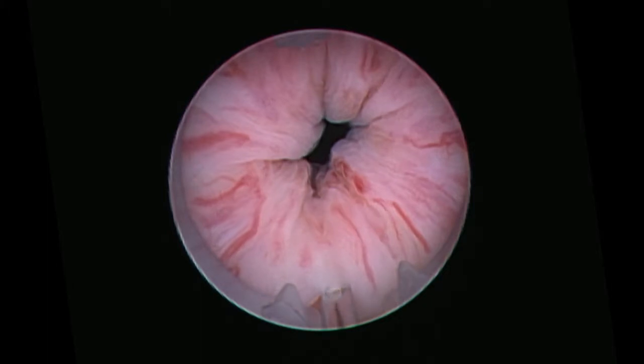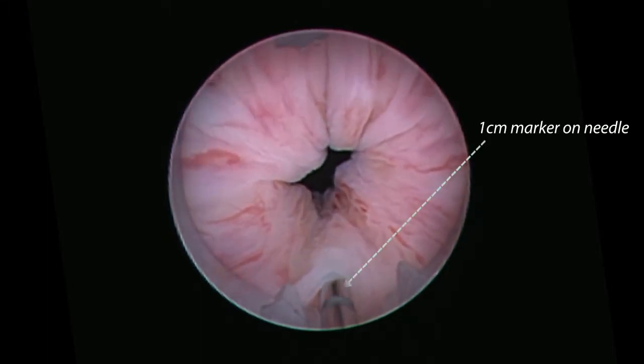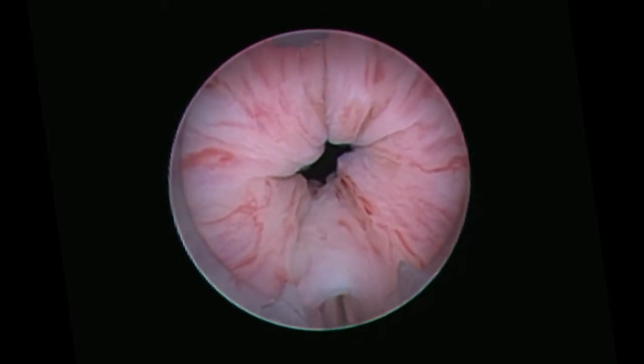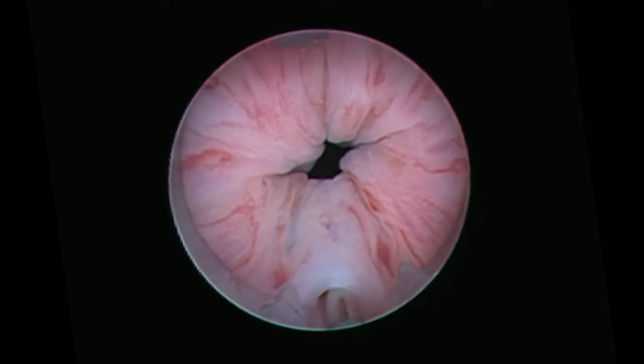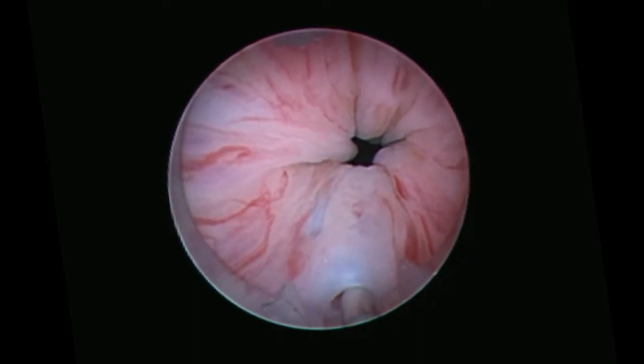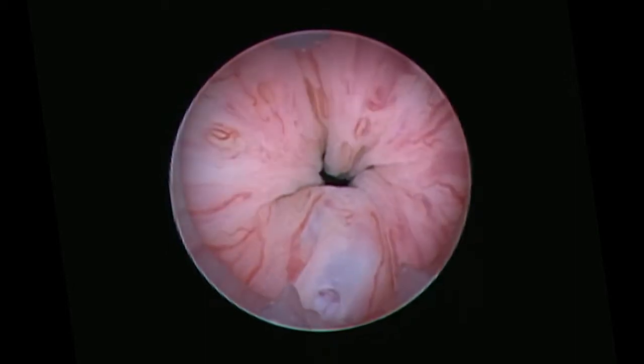Advance the needle into the tissue parallel to the urethral wall until the 1 centimeter mark on the needle is aligned with the tissue surface. Inject the Bulkamid hydrogel into the proximal part of the urethra until the tissue reaches the midline of the lumen. The needle can be retracted immediately without displacing the gel.